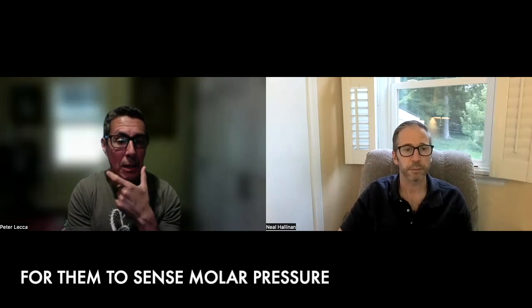And then there's another appliance, really quickly, that doesn't necessarily have the anterior guidance. It's more to give the patient an immediate posterior occlusion a lot of times, and there are specific reasons where you use one or the other. Do you know what those are? Having spoken to you, I know you prefer the splints with anterior guidance, I believe.